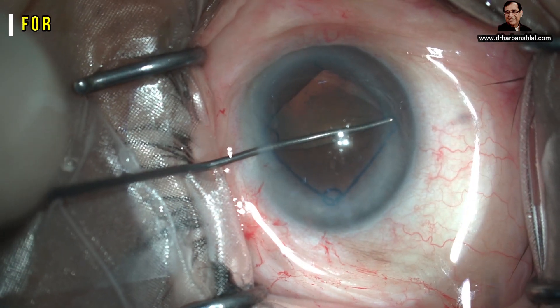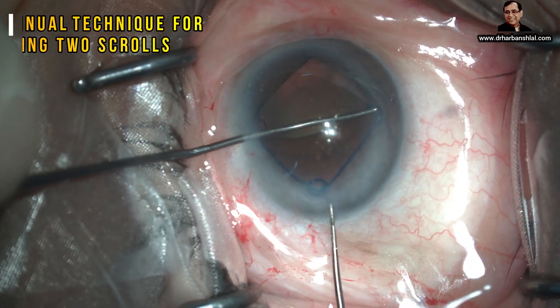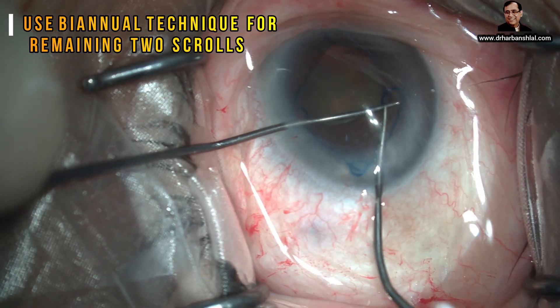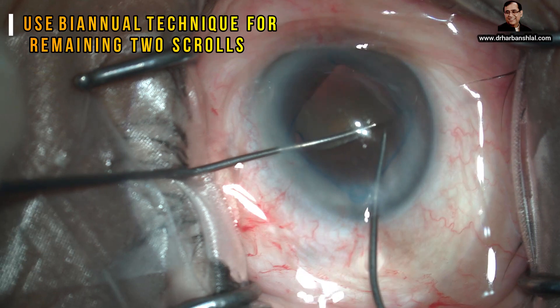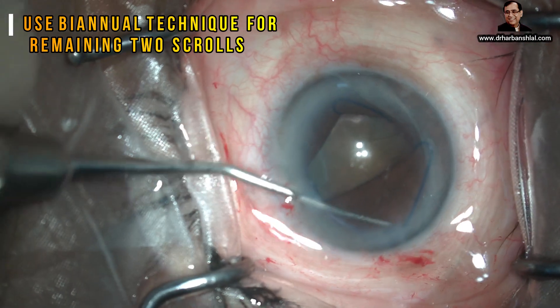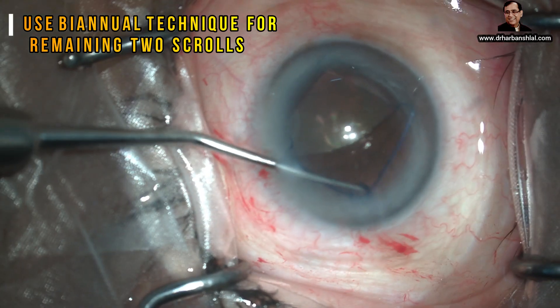Now do not pull it back — it may get disengaged. Rather, use a second instrument to help you disengaging the dumbbell dialer. Now this is the toughest part. You can see the iris border is reaching virtually to the center of the lens.